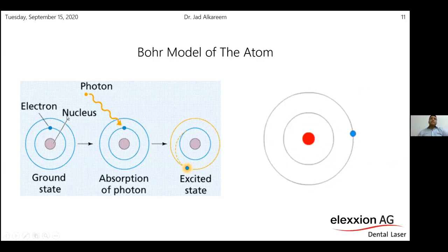As I mentioned, to produce any kind of energy, we have to understand this equation correctly. We have the atom, and inside the atom we have a nucleus, and around the nucleus we have the electrons, which are moving in a normal movement during the ground state. If we want to produce energy, we have to excite this atom through an external stimulator.